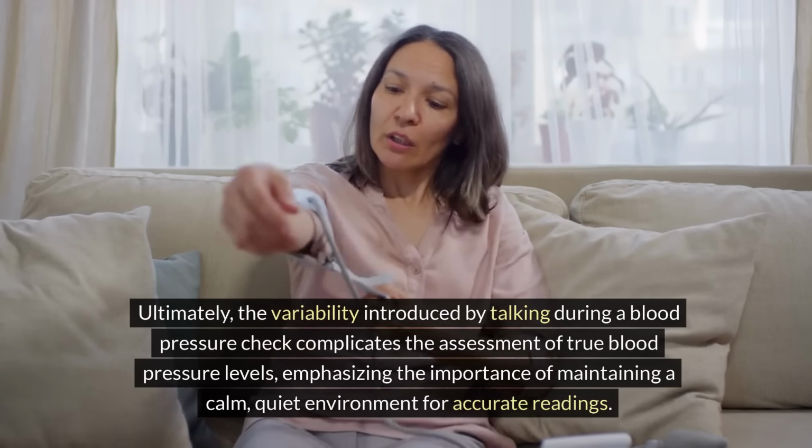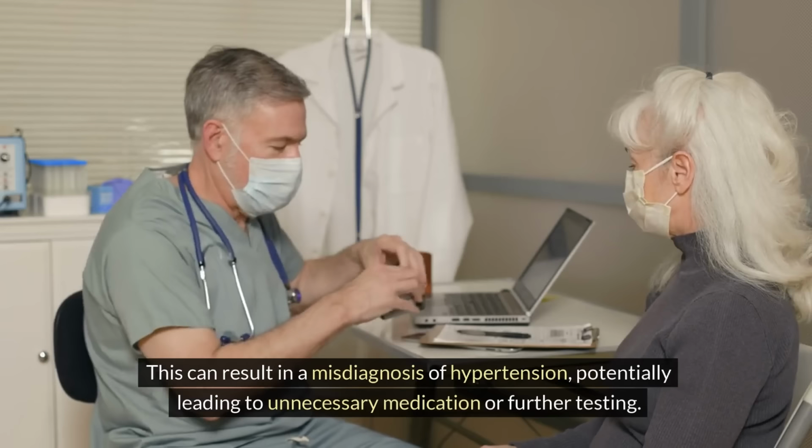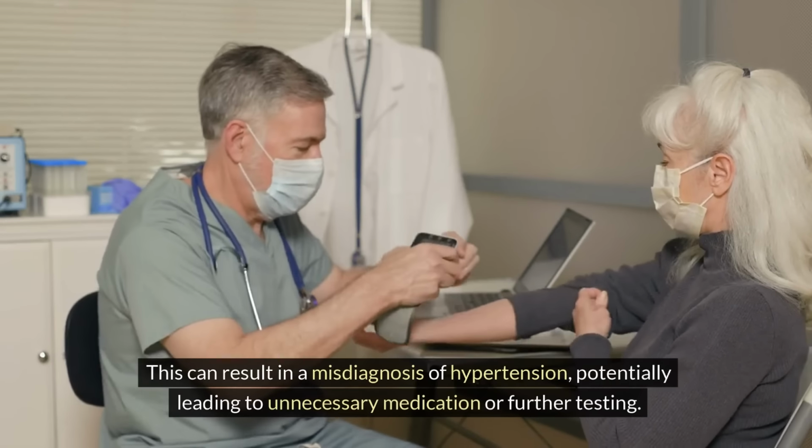Failure to rest before taking a blood pressure measurement can lead to elevated readings, as the measurement may capture the temporary increases caused by recent activity. This can result in a misdiagnosis of hypertension, potentially leading to unnecessary medication or further testing.